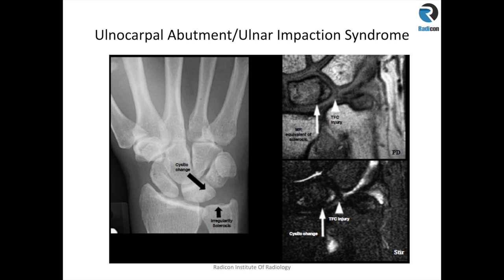In a positive ulnar variance, as you can see on this radiograph, with repetitive microtrauma, movements, or stress, you get cystic changes on the ulnar side of the lunate. You get this radiolucency on radiograph. On MRI, you see marrow signal changes on the ulnar side of the lunate and cystic changes on the STIR or water-sensitive sequences. You should be thinking about abutment or impaction syndromes due to abnormal anatomy in this region.